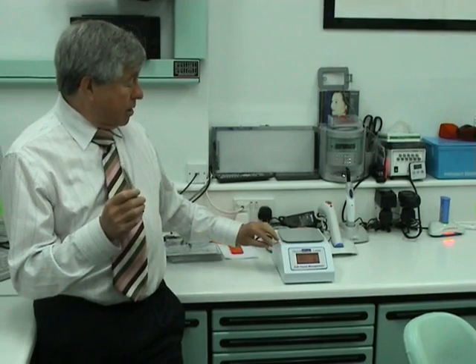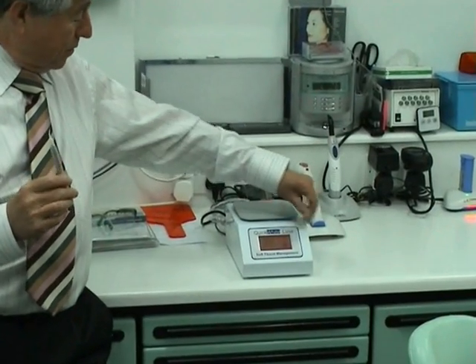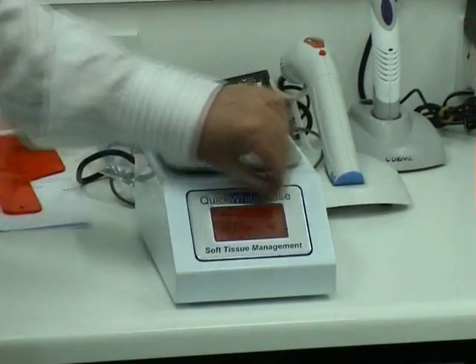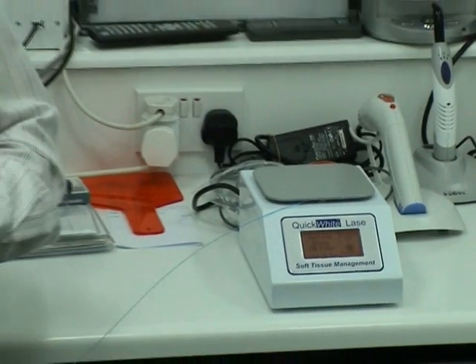This has got an incredible system — I think they call it a caddy — where you just wind the cable in, just as much as you need, and you put it back and wind it up. So for us it's been brilliant. It's really simple to use and simple to move around. That's why I can actually keep this one in the surgery.